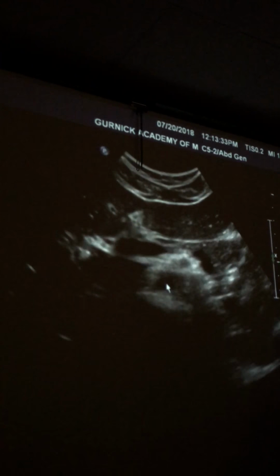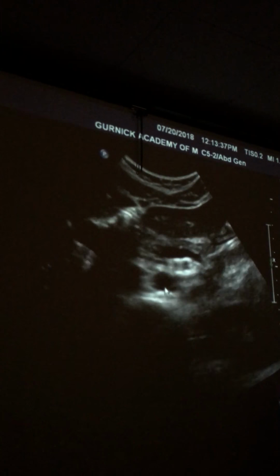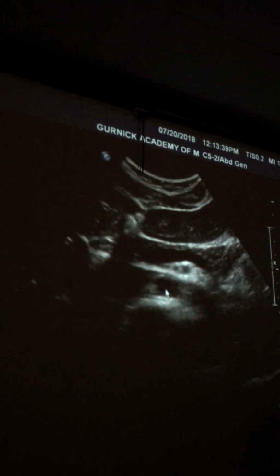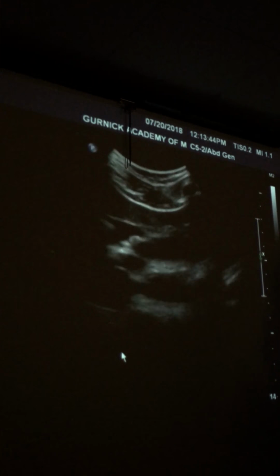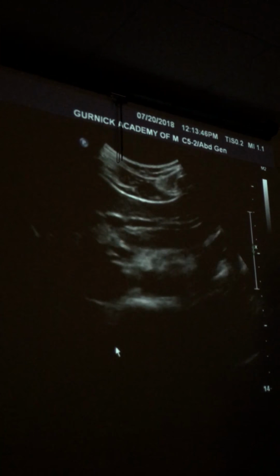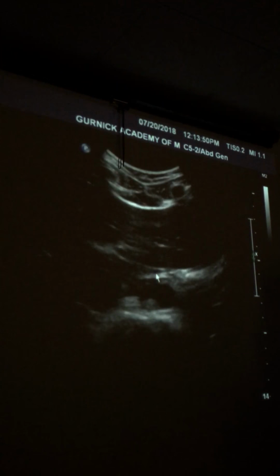So, and then the celiac. So I know if I see my renals, which way am I moving my hand? More proximal or more distal to find celiac? Proximal, good. So here I'm coming up, and now I see something going on right here. See that? How I just saw something pass? Yeah. Then I know I passed it.